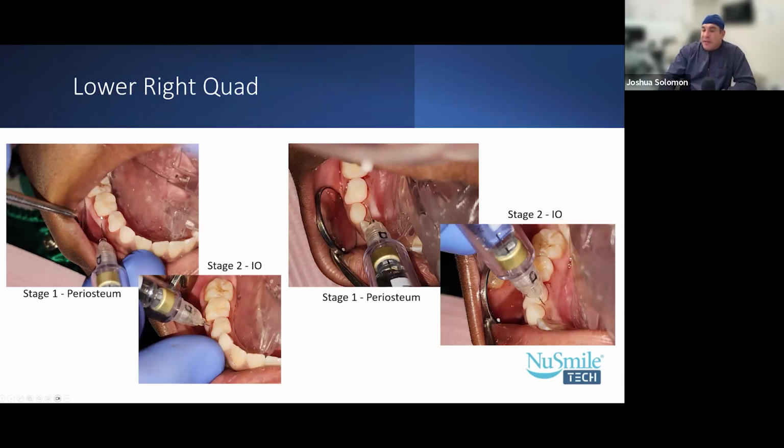I would typically, we call it an average, this is a quote unquote intraosseous block now, where you're giving one stage and your second stage. Remember, you can give it on the lingual surface, especially if you have an infection here. You need to make sure that we're delivering in organized bone. So if you have an infection, or let's say you don't have really any roots that are here, and it's mostly soft tissue, and you want to make sure you're getting into that bone, I will rotate and give on the lingual surface.